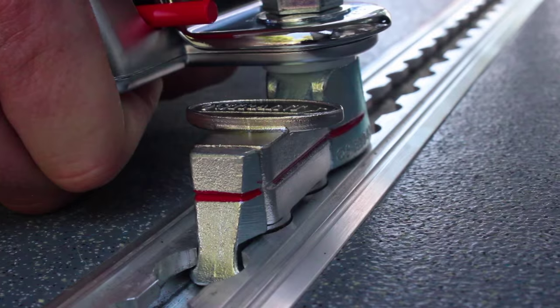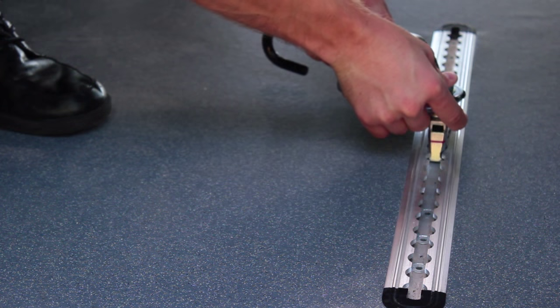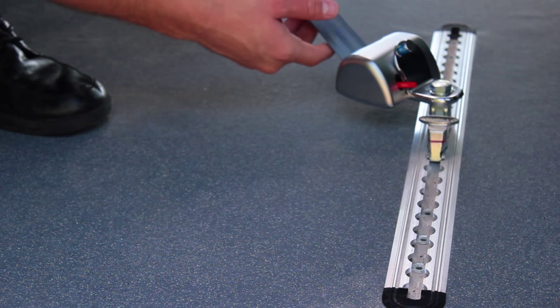To adjust the tie-down restraint, lift up on the tab and slide along the tracking. Release the tab and make sure the tie-down is securely in the groove.